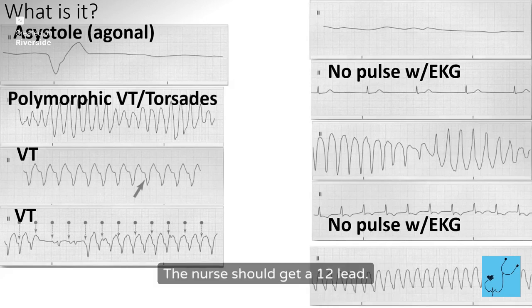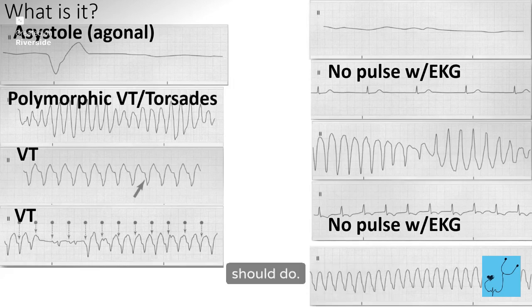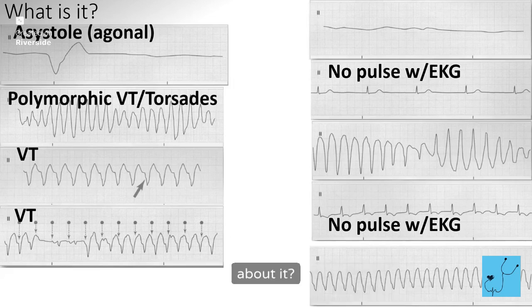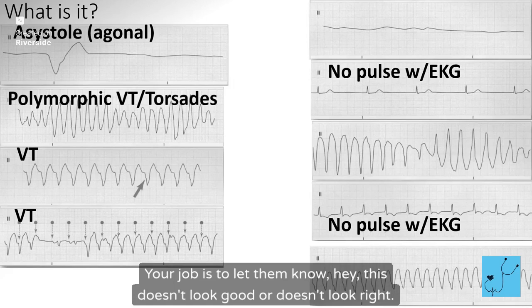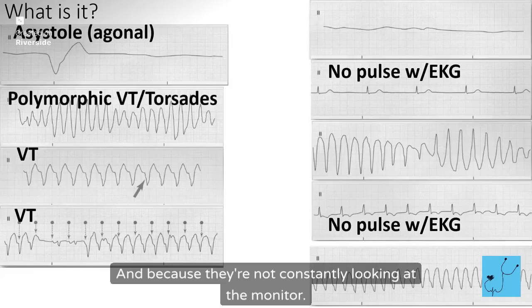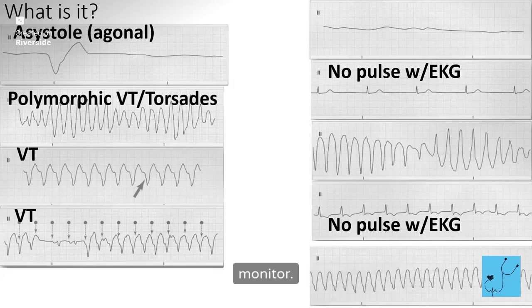The nurse should get a 12 lead if the patient looks fine. The nurse goes and looks at the monitor, which is what they should do, and they think it's something else. That's their responsibility to figure out what it is and what they're going to do about it. Your job is to let them know, hey, this doesn't look good or doesn't look right. It doesn't look the same way it did. Because they're not constantly looking at the monitor, you're just helping them out to be their eyes.